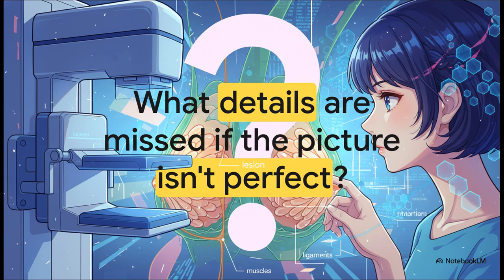So, let's end on this thought. If a mammogram is telling the story of a person's health, what crucial plot points, what tiny details are we missing if that picture isn't perfect? From the angle of a machine to the shape of a muscle, technical perfection isn't just some nice-to-have goal, it is the absolute foundation of a life-saving diagnosis.